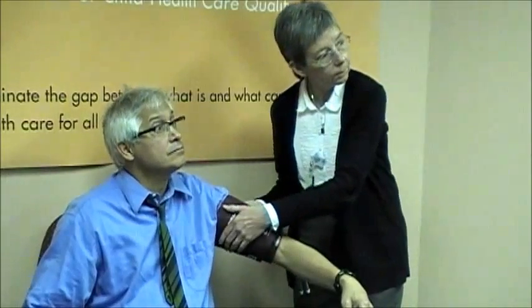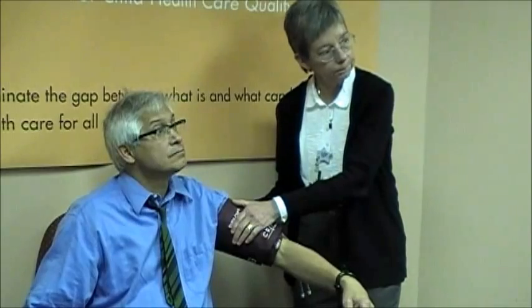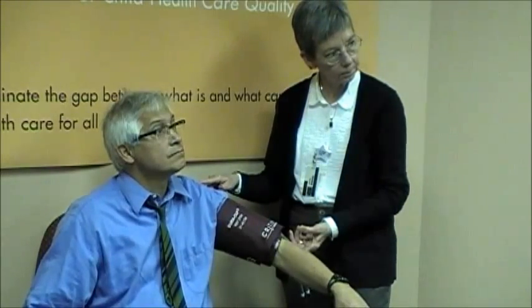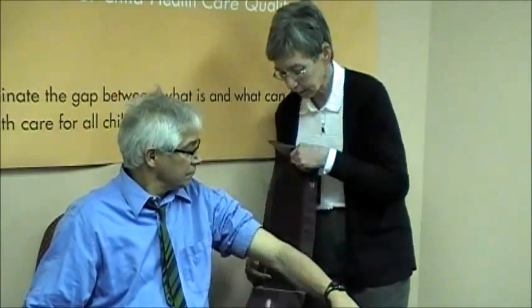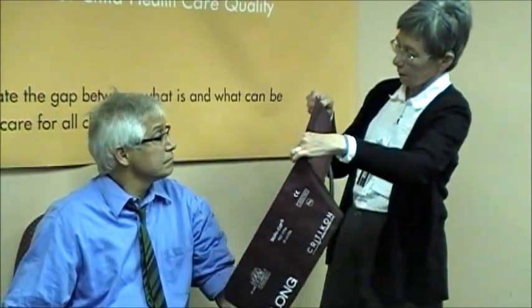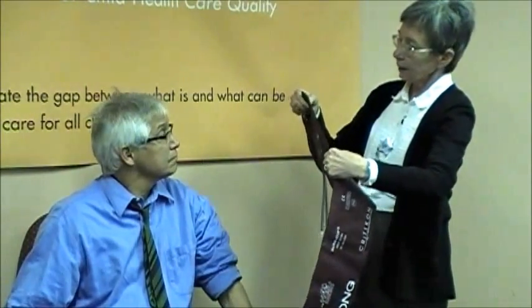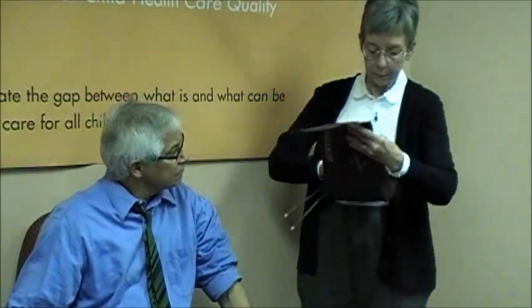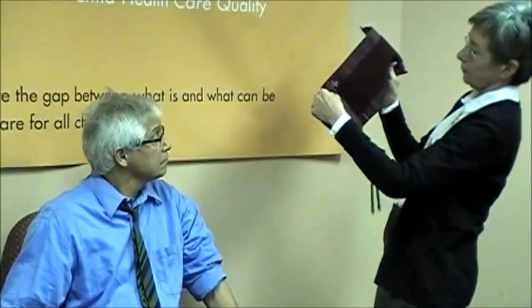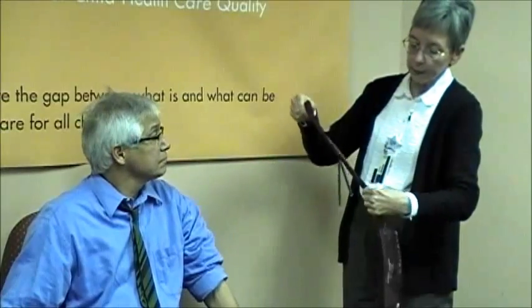In response to a question: yes, 67 to 75 percent of the length of the upper arm is correct. And 80 to 100 percent refers to bladder length. The bladder is this portion here — it's a bit hard to see, but there are lines on either side of it. Most cuffs will include these indicator lines to tell you whether you're choosing the appropriate cuff size. These lines indicate that you're in the correct range, and they serve as a good approximation of the bladder as well.